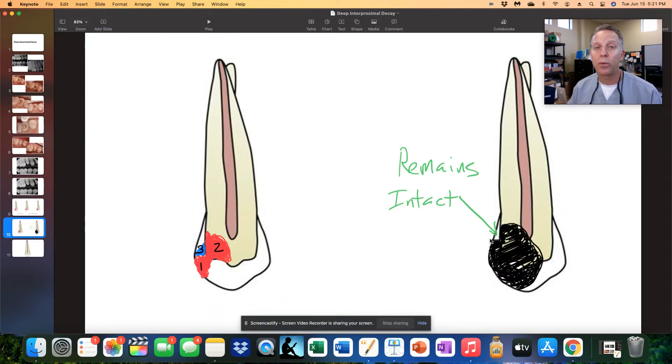This case turned out really nicely for the patient. When you're going in and doing your preps on deep interproximal decay, take it easy when you get to this part. Don't push it — because if you pushed it too far, you'd come out right about there, and we all know what's right there: you're subgingival and maybe even sitting on top of the bone. So keep this area intact.